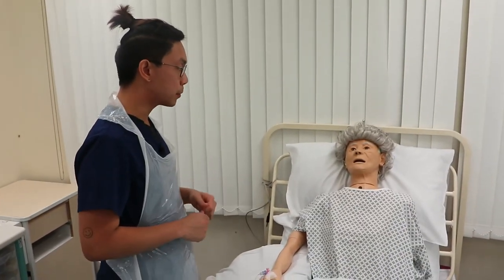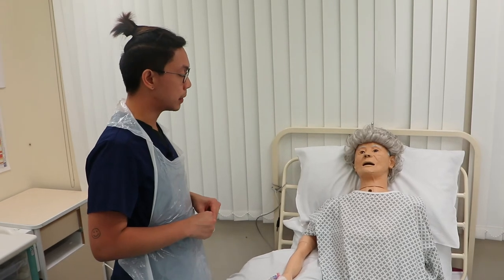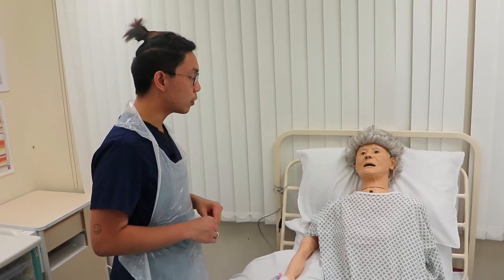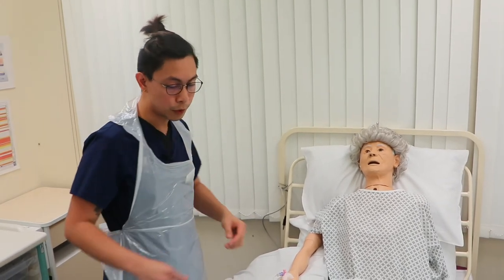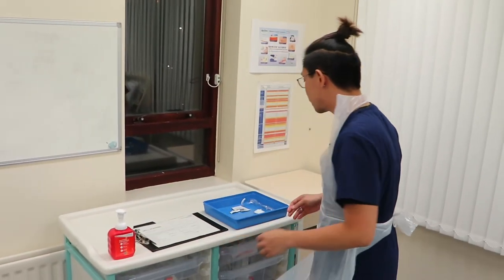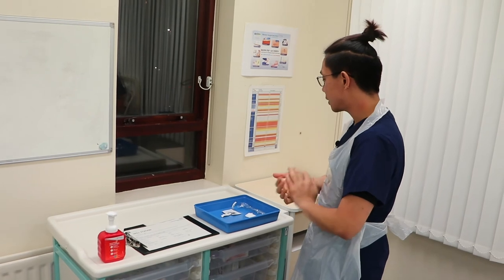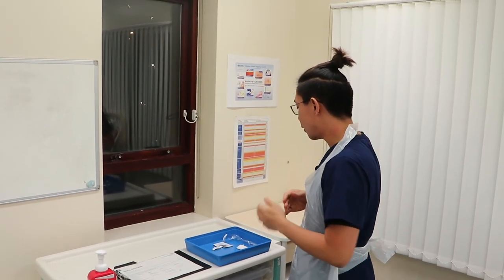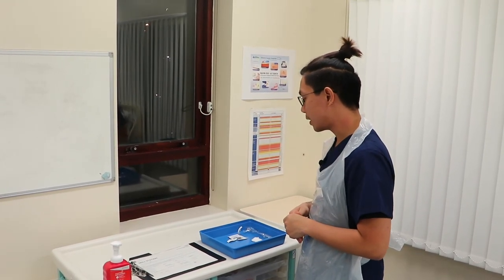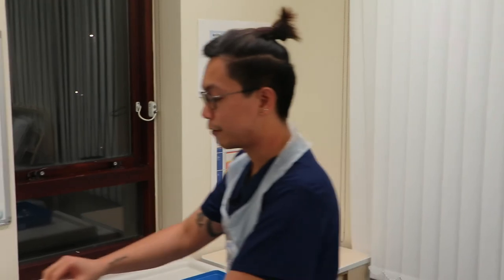Catherine, I'm done with the procedure — how are you feeling? — I'm all right. Just to remind you, I'm still here to monitor you for 30 to 60 minutes. I'll take my materials to the other room for aftercare — if you need me, just call and I'll assist you. I'll do a quick hand rub, put on a new pair of gloves, and dispose of everything that touched the patient into the clinical waste bin. Wrappers go to the domestic waste bin. The tray will be cleaned and disinfected for next use, and my apron and gloves go to the clinical waste bin. Now for final documentation and final hand washing.